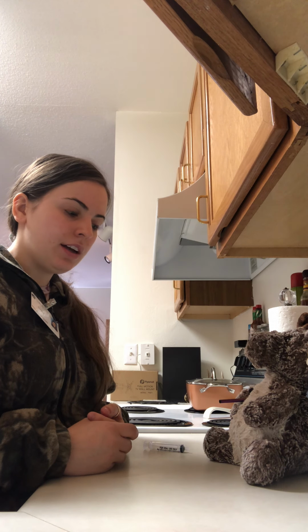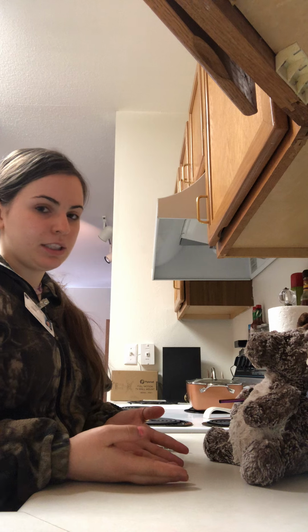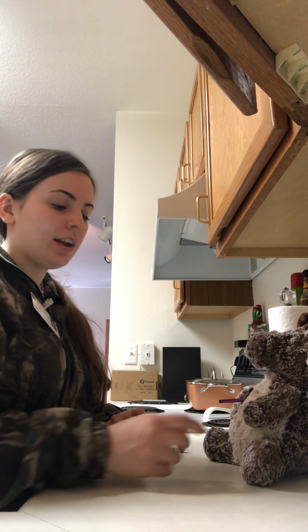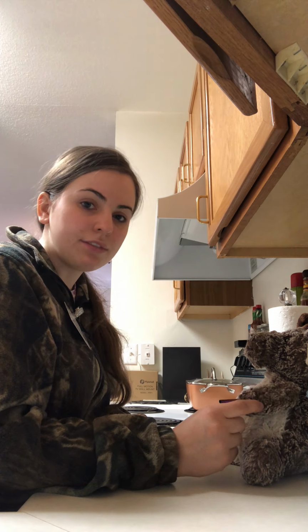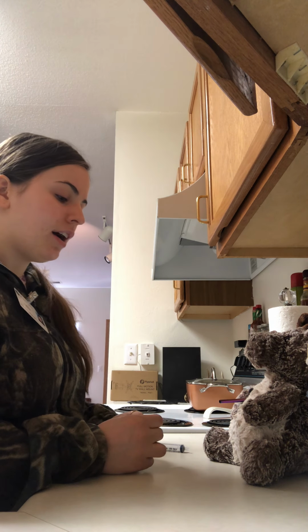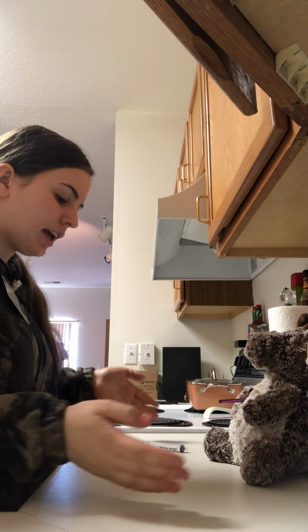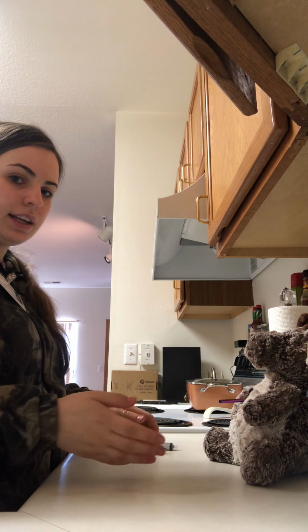Then I would have the patient state their name and date of birth for me, and he would tell me he's Mr. Moose and his birthday, and then I would check his wristband versus the MAR to also ensure that it's the correct patient. And then I would provide privacy, and I would wash my hands, and I would set up everything I need in the order that I need to use it.